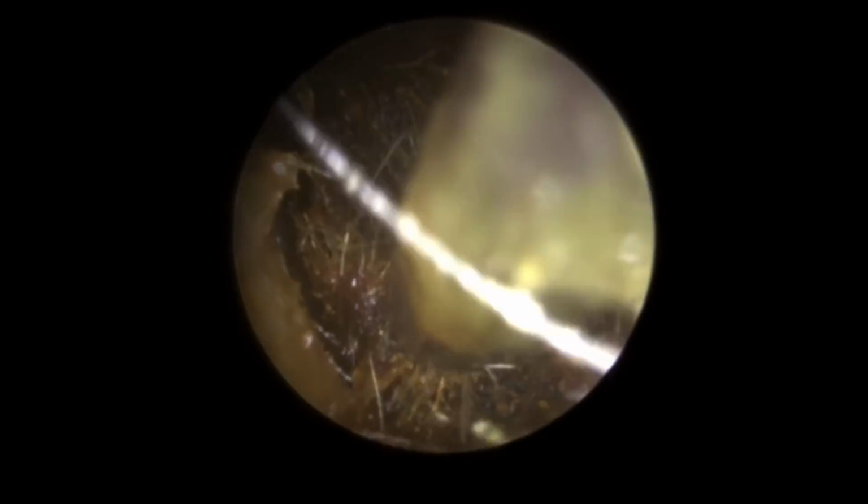Try to stick with the Jobson horn as much as I can, but what you'll see with this is instead of a lot of the times it folds the wax forward, it's actually just dug into the wax and broken another chunk off the front, which means it's going to be a little bit more difficult now to get behind that top section with the Jobson horn again. So using the standard size Zollner tube once again now just to lift and move all these sections of wax back into the center again.